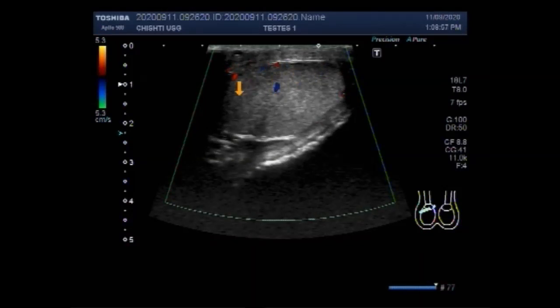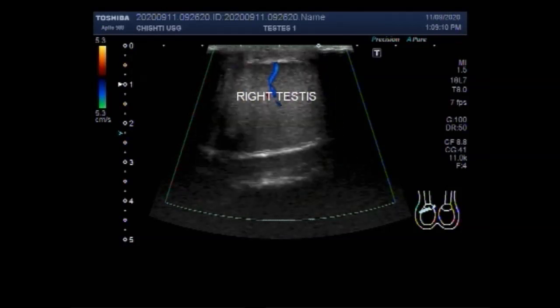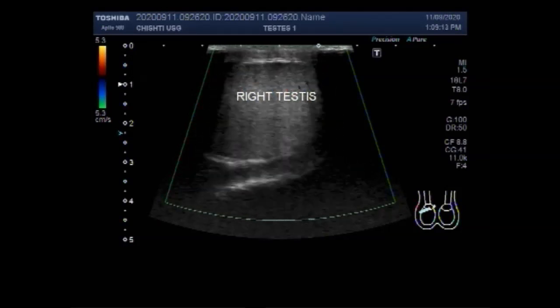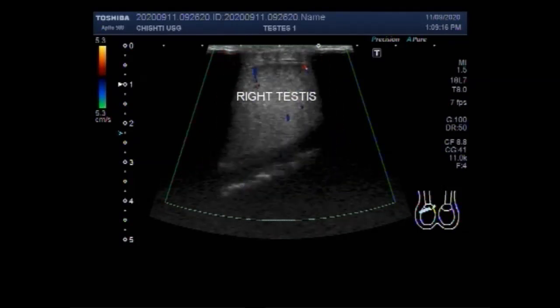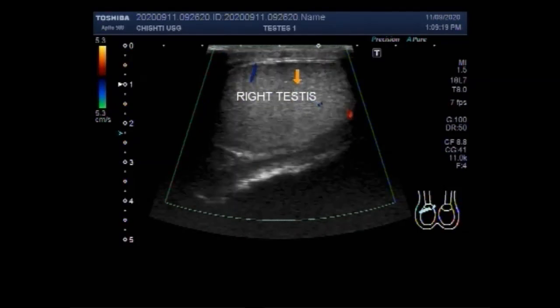This is the right testes, and it is echotexture normal. Blood flow is also normal. No mass, cysts, or foreign body is seen in the scrotal sac. This patient was examined five weeks after the initial traumatic injury.